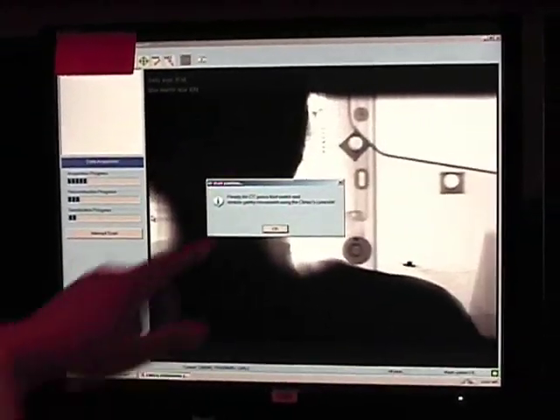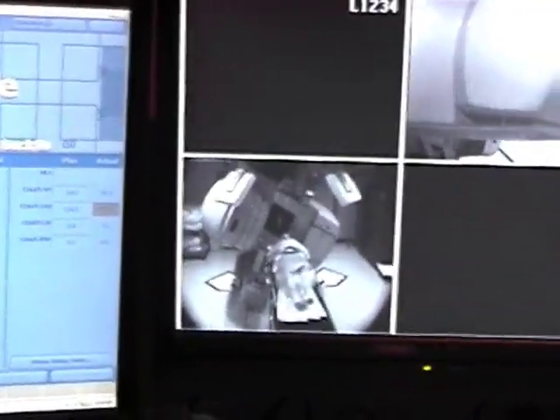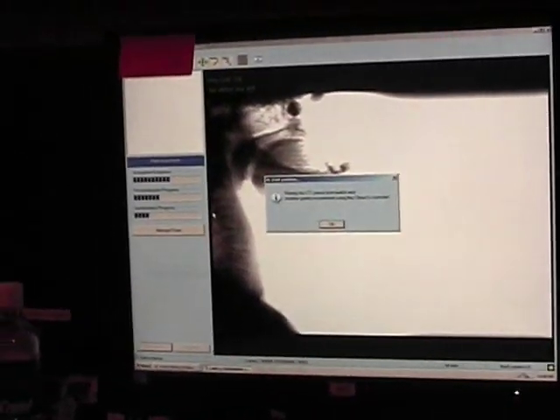And as you can see, we use a very fancy head holder system, which is practically radiolucent. It's important for image quality consideration and also for IMRT consideration. Good editorial for the head holders. At least that's the head holder we're using this week. If you notice, that head holder is radiolucent, even in KV X-ray, which is very important, so it doesn't attenuate any MV beams. You see the head holder now? Basically, it's radiolucent.